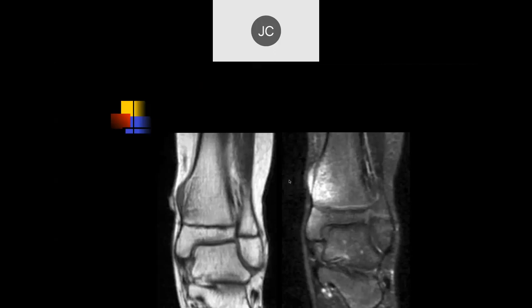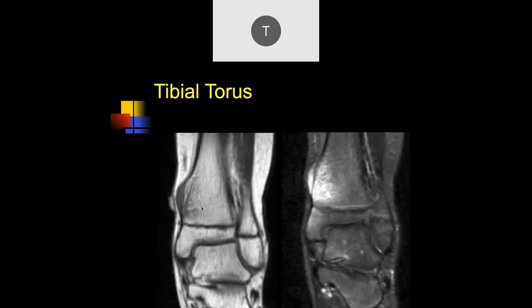At the metadiaphysis medially in the tibia, there's lifting of the periosteum — possibly periosteal hemorrhage. This patient has not-quite-completely closed growth plates. This is a buckling or tibial torus fracture. These will heal quite well with conservative treatment, typically in a cast, as children are dependable with compliance. This doesn't look displaced, so it's not a high-risk injury and just needs to be allowed to heal — within three to four weeks in a cast.